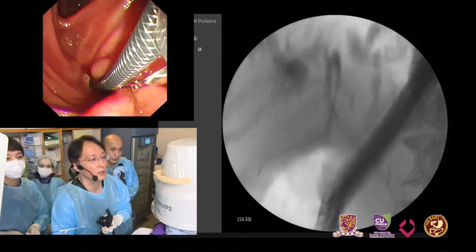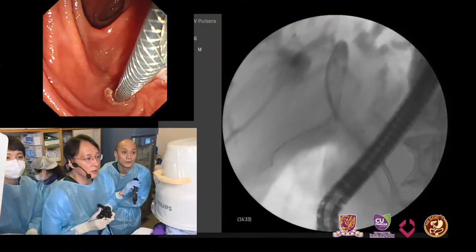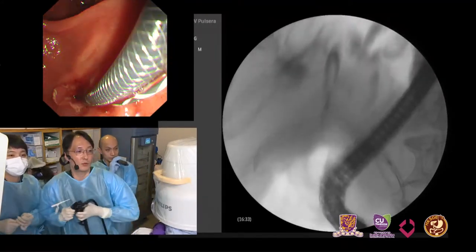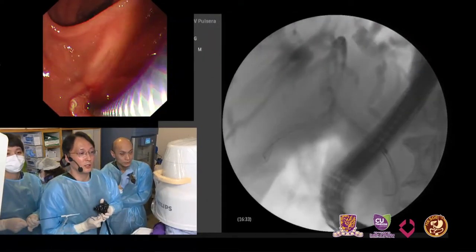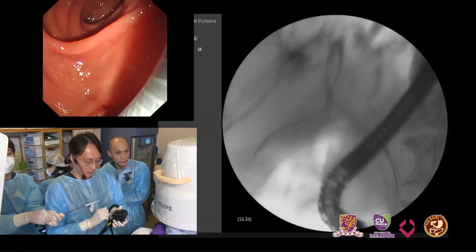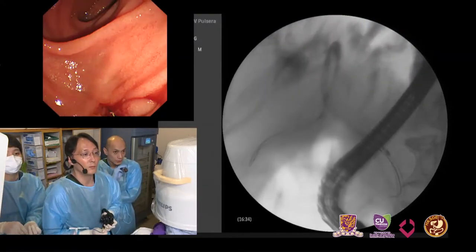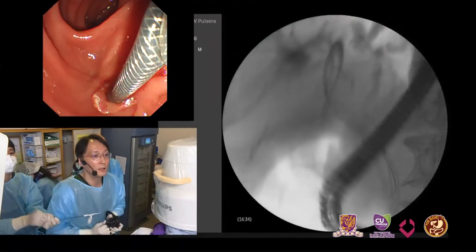It's a very acute angle. Sometimes I use a right turn like this one, which is easier for pushability, but we need some muscle sometimes. It should be okay. I mean, if you open it, it will probably go forward okay. A bit more.